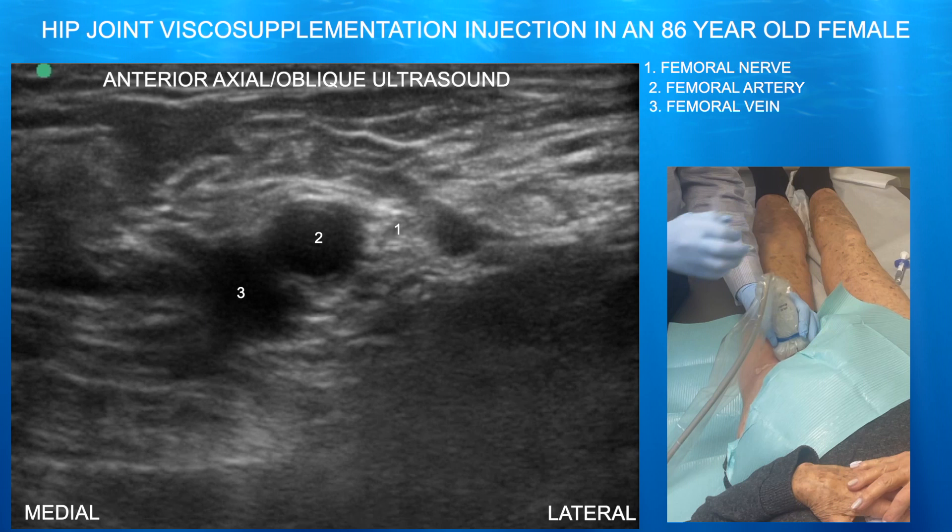Here we're now looking at the groin region in axial plane, trying to make sure we're not going to be over the vasculature when we do this procedure.